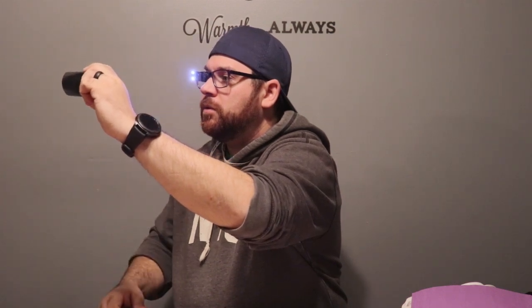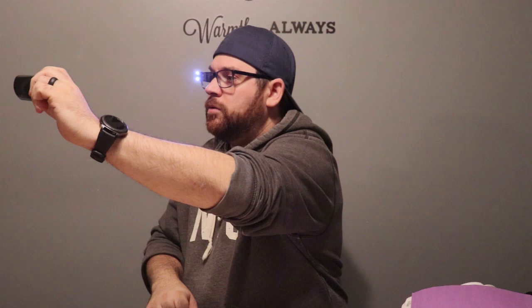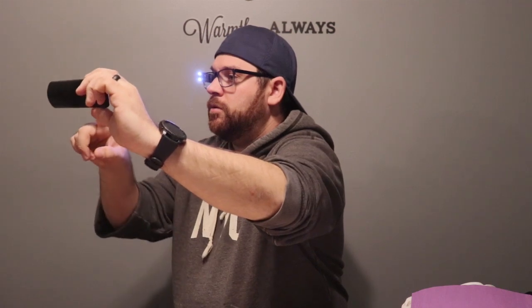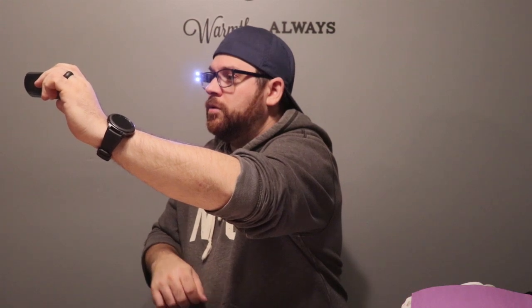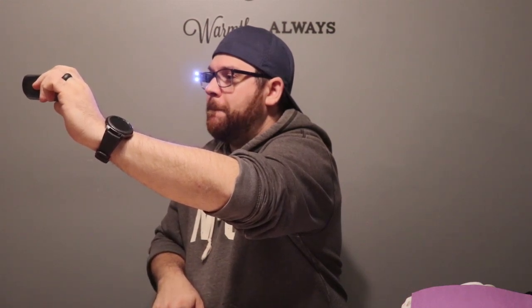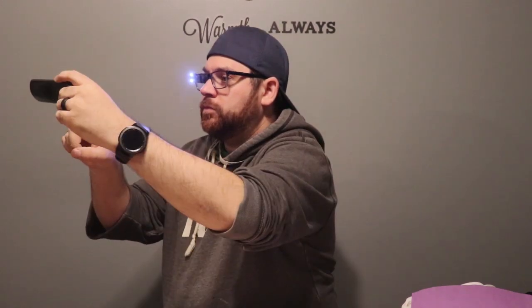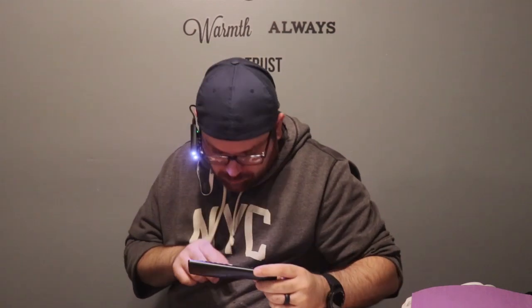Start new product learning. Please point at the product 3 times at different positions. Let's try again. Please point at the center of the product 3 times. For example, hold it once at arm's length, once closer, and then once against a different background. Done with this side, you may point 3 times at another side of the product or stop now. Stop now.